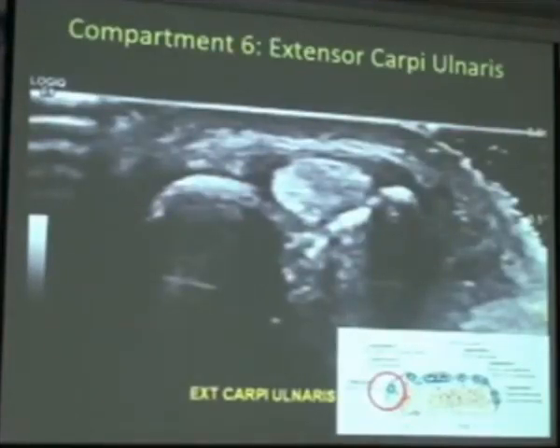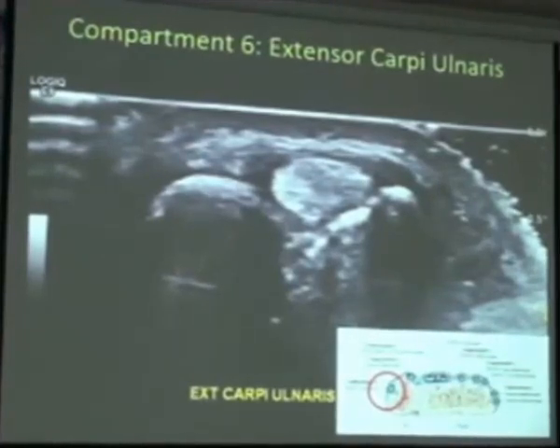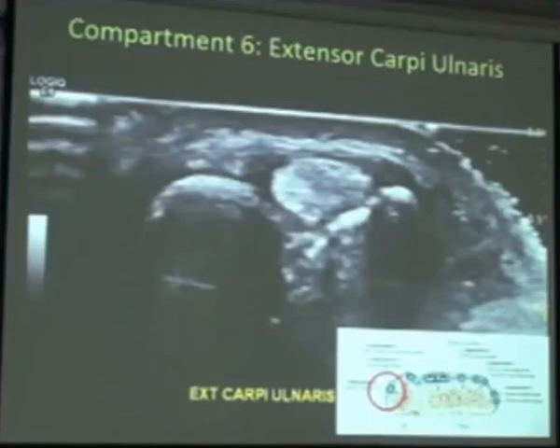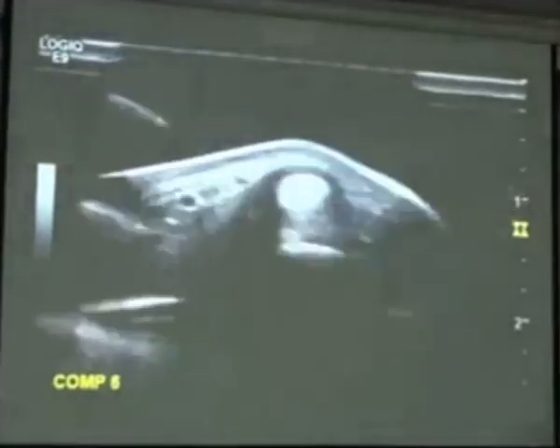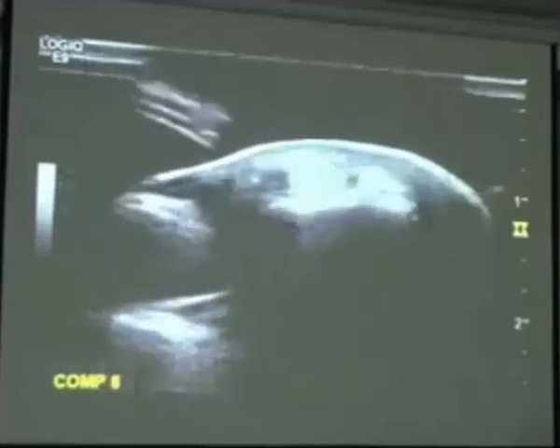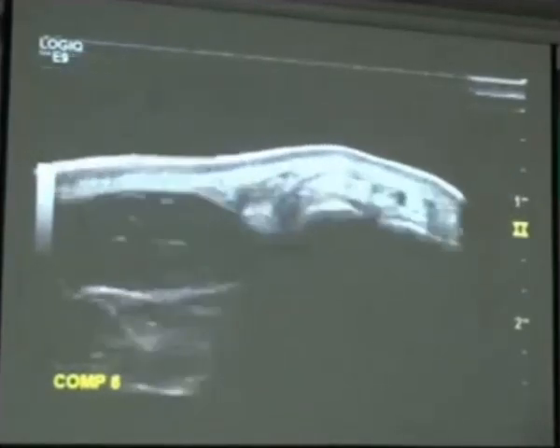Moving across to compartment six, which is extensor carpi ulnaris, coursing down on the ulnar aspect of the distal wrist. It can be affected by tenosynovitis or instability due to deficiency in the retinaculum that holds it in place. By utilizing dynamic scanning, we're able to see if this tendon subluxes out of that groove, watching the course of the ECU as it comes down from the distal wrist over the ulnocarpal joint and extending down onto the phalanx.